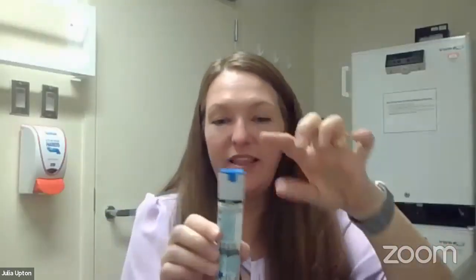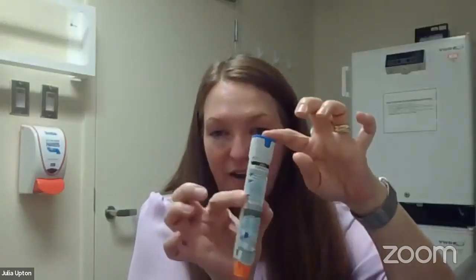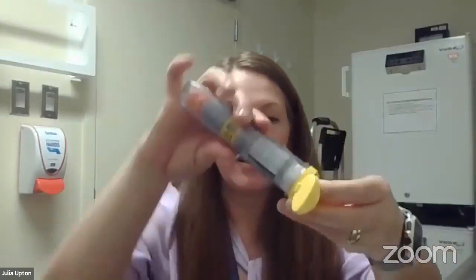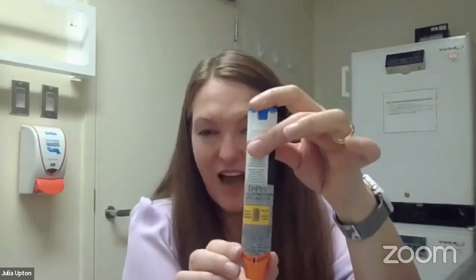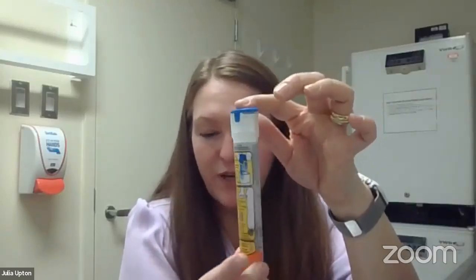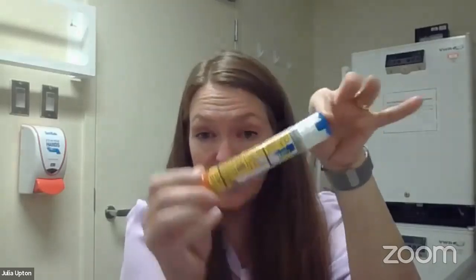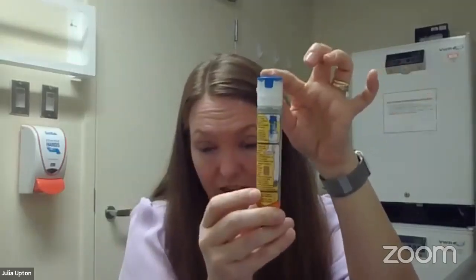Great. So this is the epinephrine, like the EpiPen demo. I just want to show you the real one instead. So this is what the real one looks like. This is a used one. They're quite different, actually. The real one, the live one, has this window where you can actually see what the medication looks like. Is it clear? Because you don't want to use it if it's cloudy.